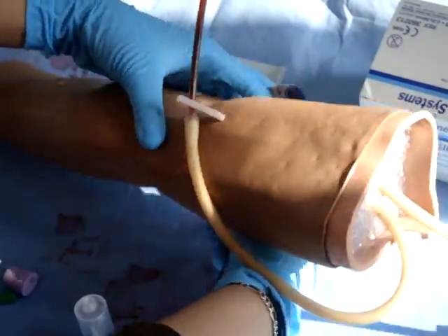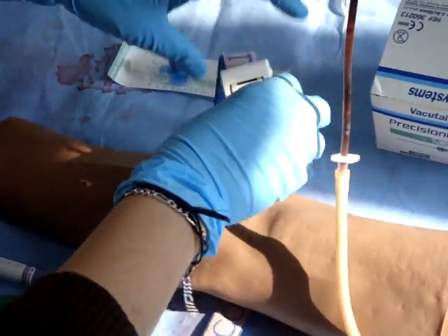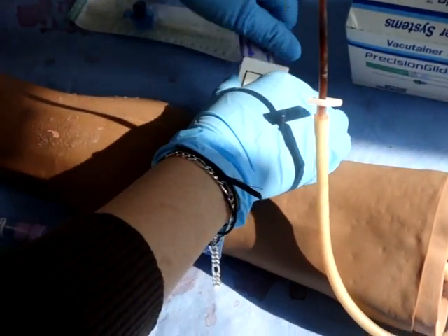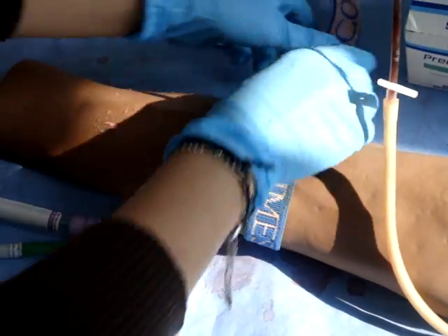How to take bloods. Step 1: Place the tourniquet over the arm and pull tight until a good vein can be found.